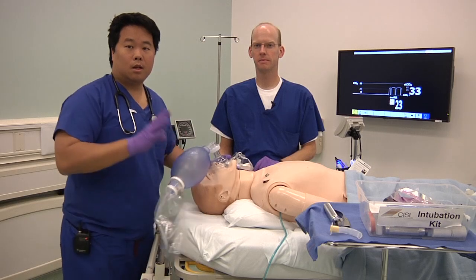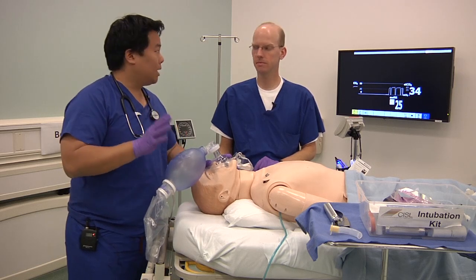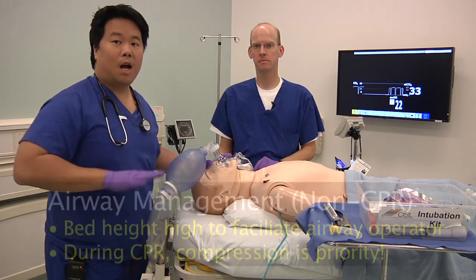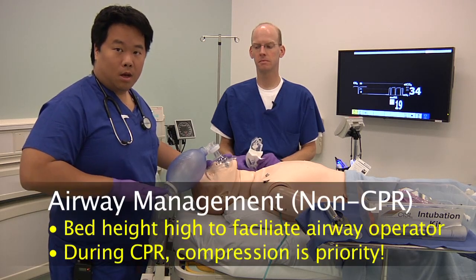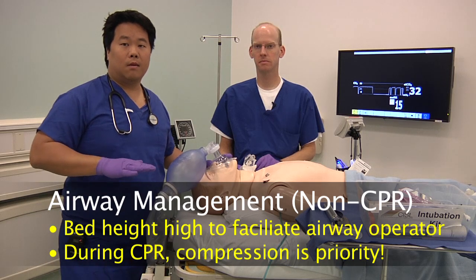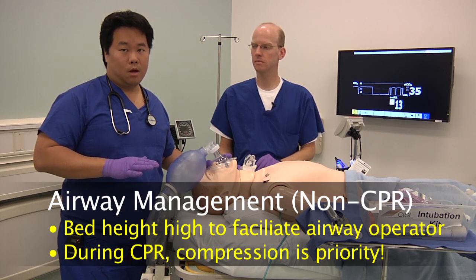So let's talk a little bit about airway management in a non-arrest setting. Now this is very different. The first thing you're going to notice is that the bed is up high. It's almost here at my belly button level. This is because the bed height at this level really helps facilitate endotracheal intubation for the operator.